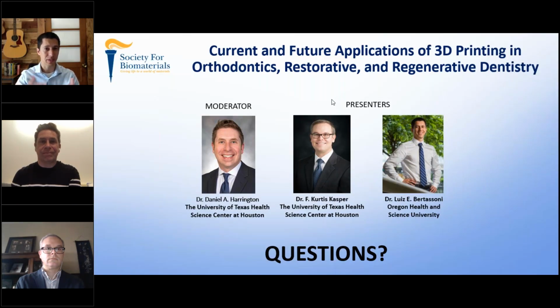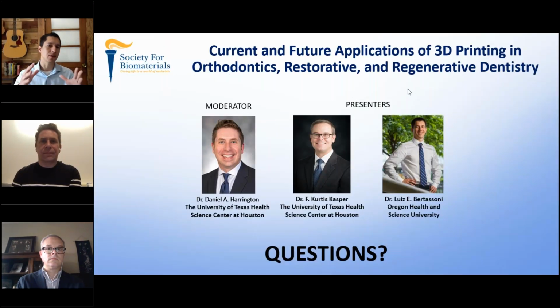These are like simpler, sort of PMMA resins, right? Which theoretically could be used for much longer, but we know that they tend to be slightly more cytotoxic, to really cytotoxic materials or not biocompatible materials that can be printed for models and other things outside of the clinic. So I think the good thing is that now there are commercially available materials that you can just go to the website and choose, and it makes our lives a lot easier. There's not a whole lot of research that needs to happen to identify that.